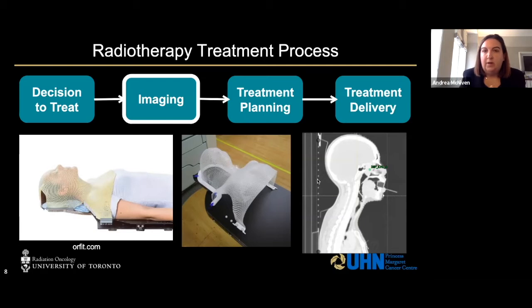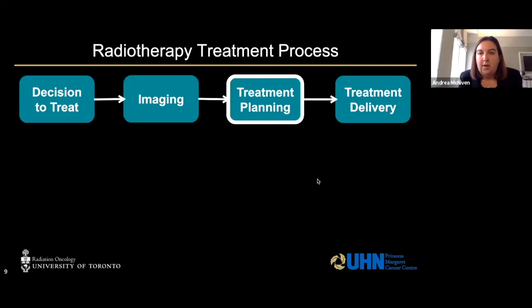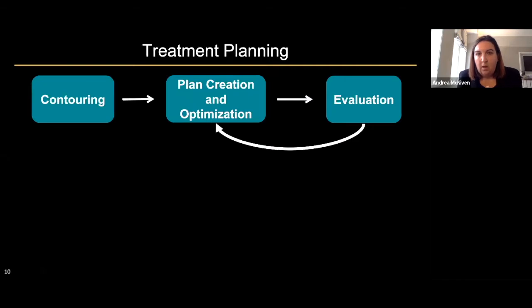These images, once they're taken, are transferred, as mentioned, to the treatment planning software. The treatment planning process itself can be quite tedious and time consuming, starting with contouring, going on to plan creation and optimization, evaluation of the plan.